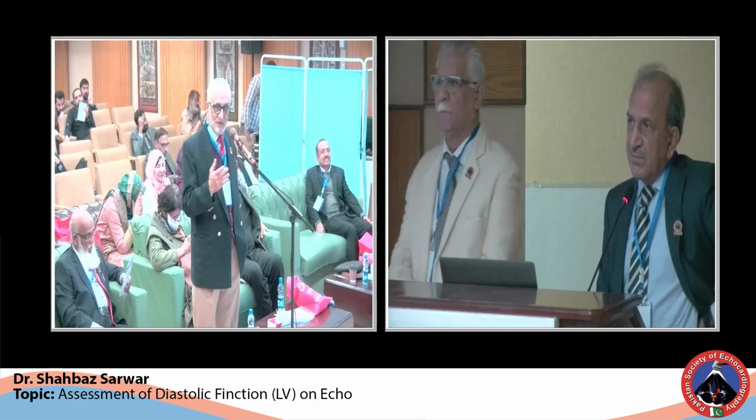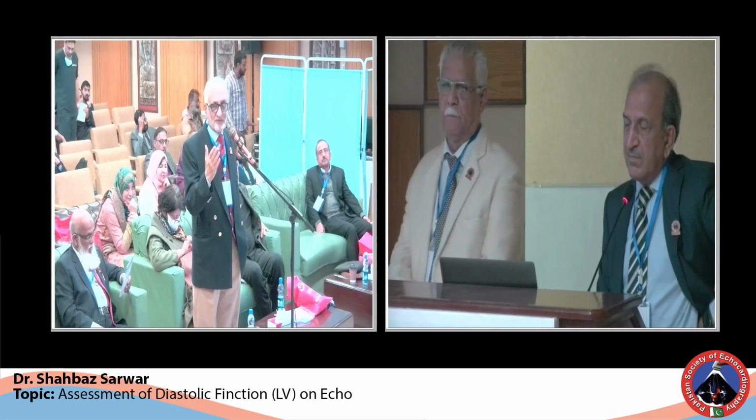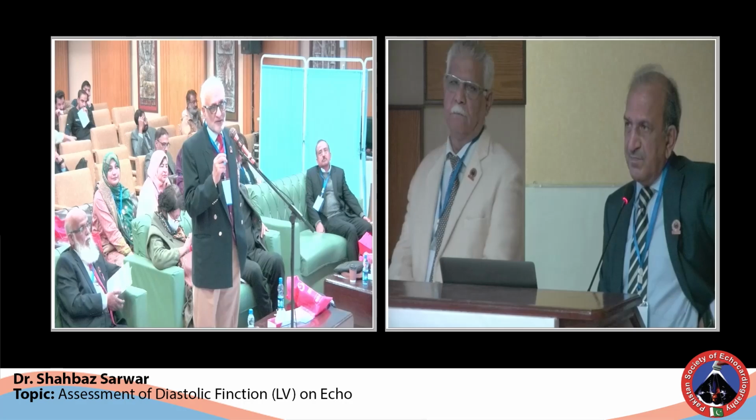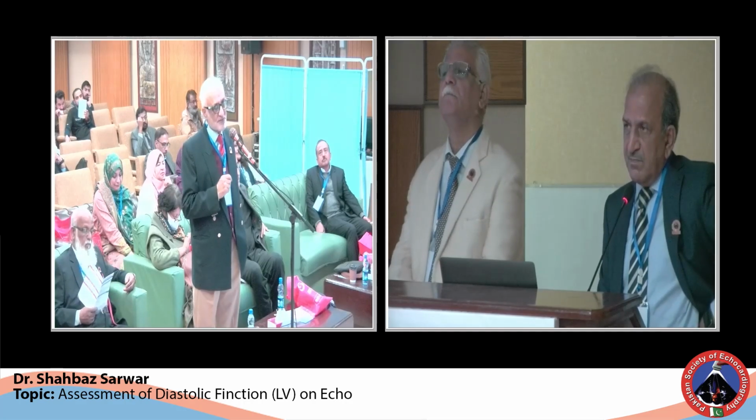So I would suggest that you have the legs raised up and do a diastolic stress test like that, and you will actually be able to find out whether this patient has diastolic dysfunction and is this the cause of breathlessness in this patient.